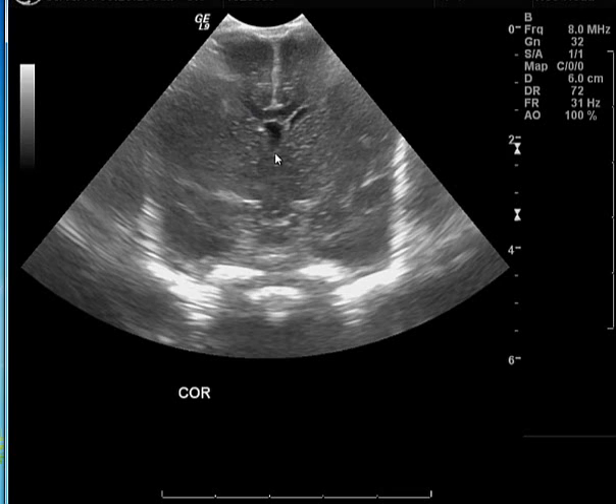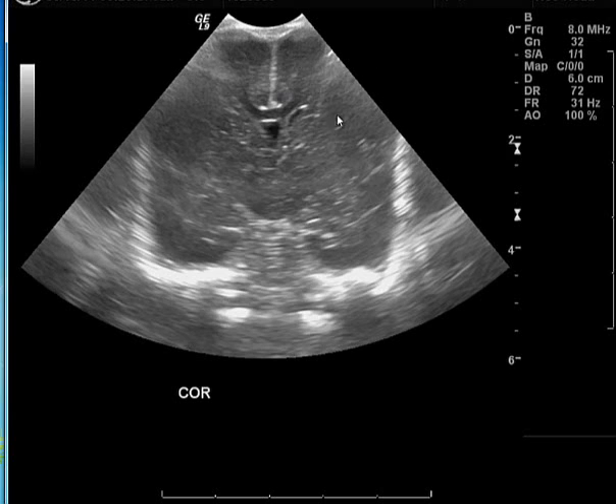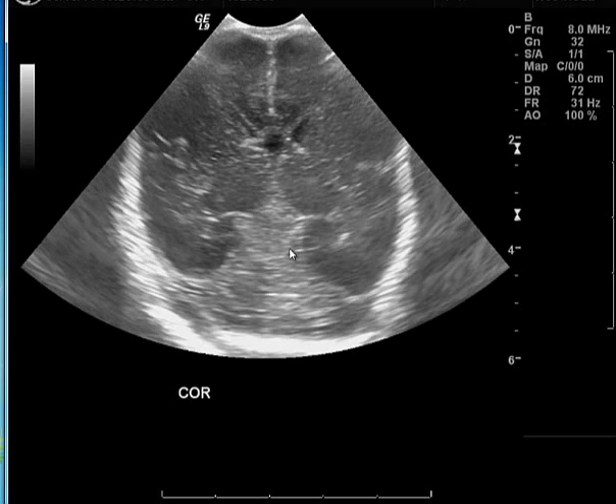Moving backwards, this is another important region to scan — the area of the third ventricle. The third ventricle is not seen in this study because it is decompressed, but that is approximately its location. You can see the temporal lobe on the right and temporal lobe on the left. Moving further posterior, you see the posterior frontal lobes on the right and left, followed by the thalami on the right and left as you take multiple sections moving from front to back.